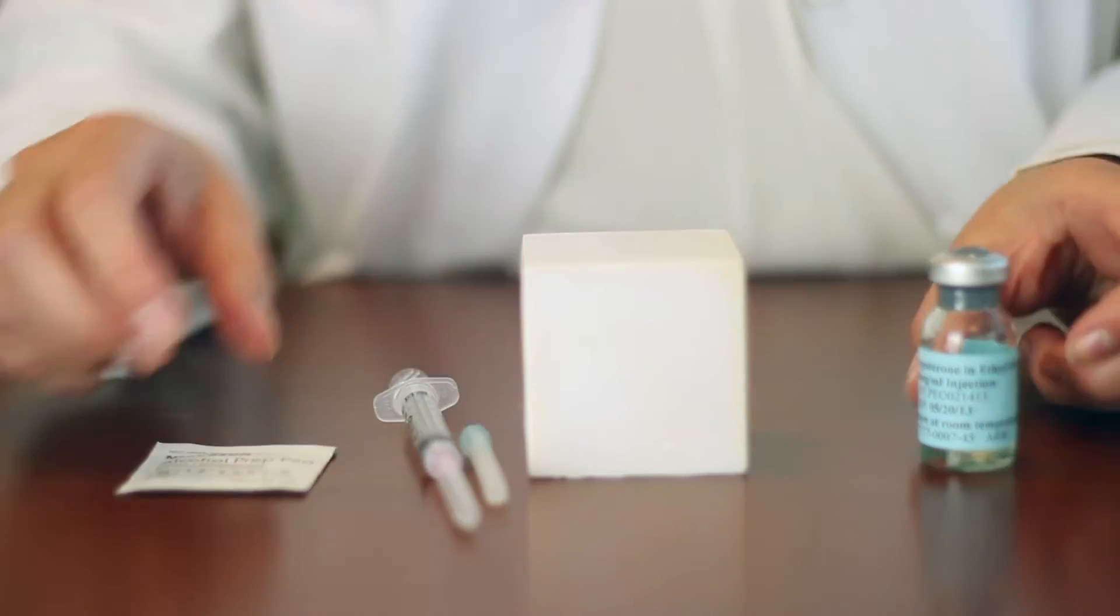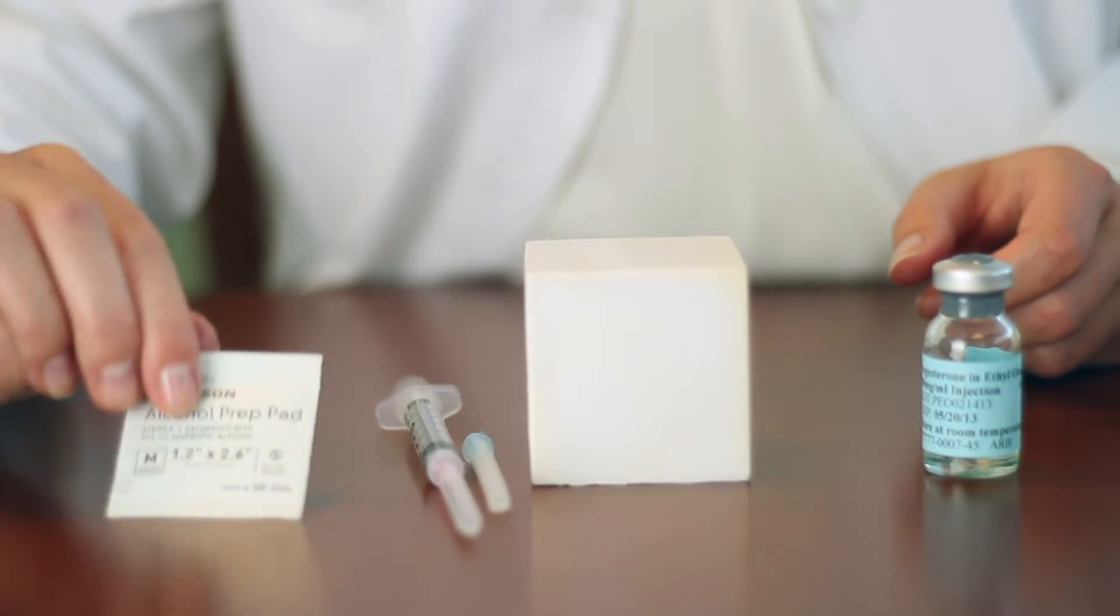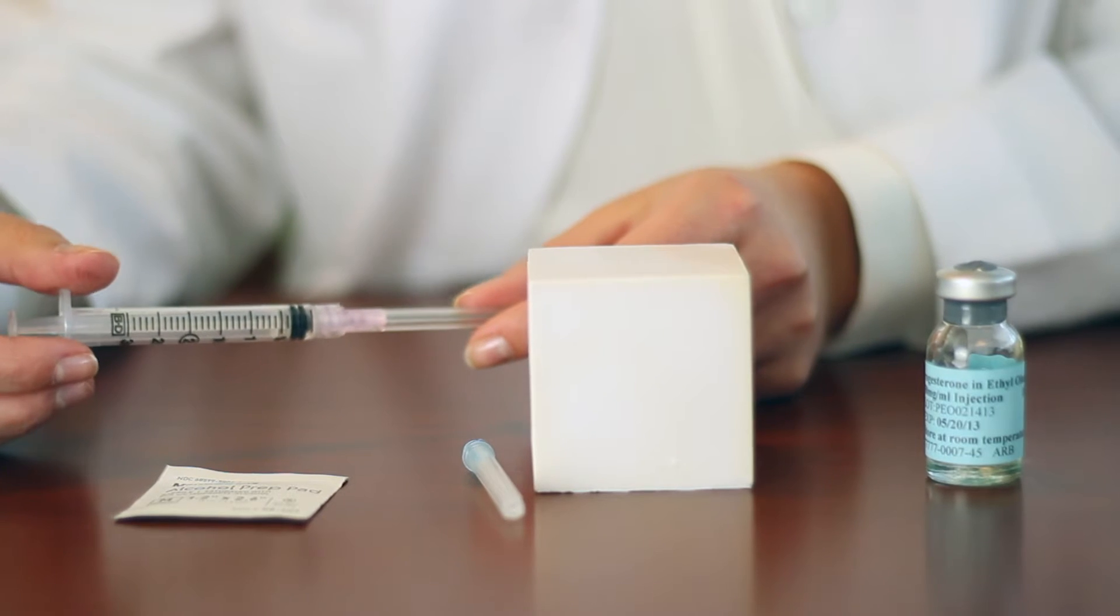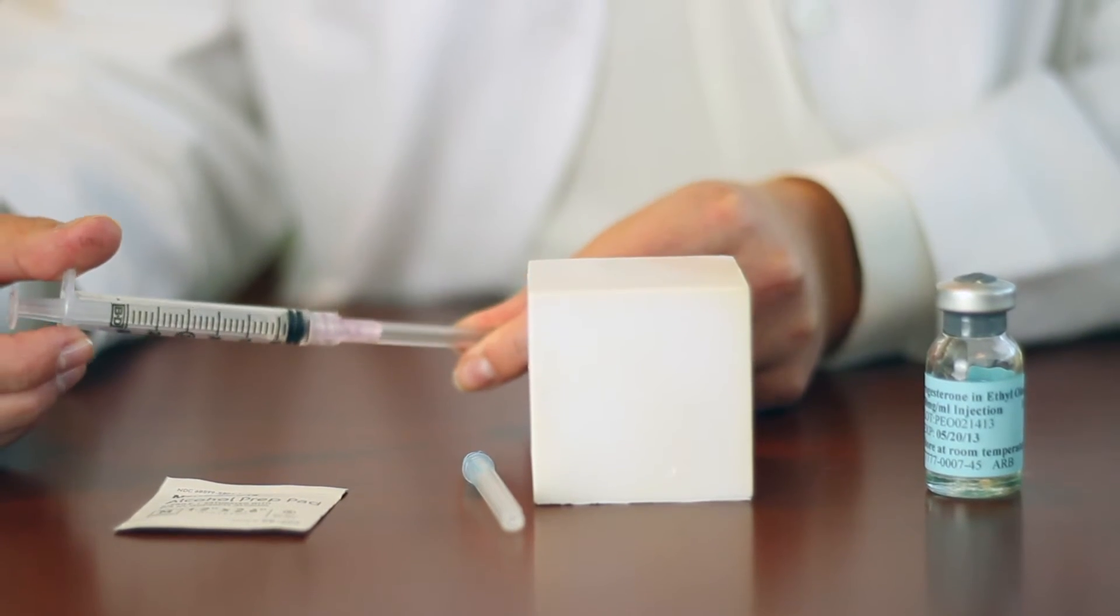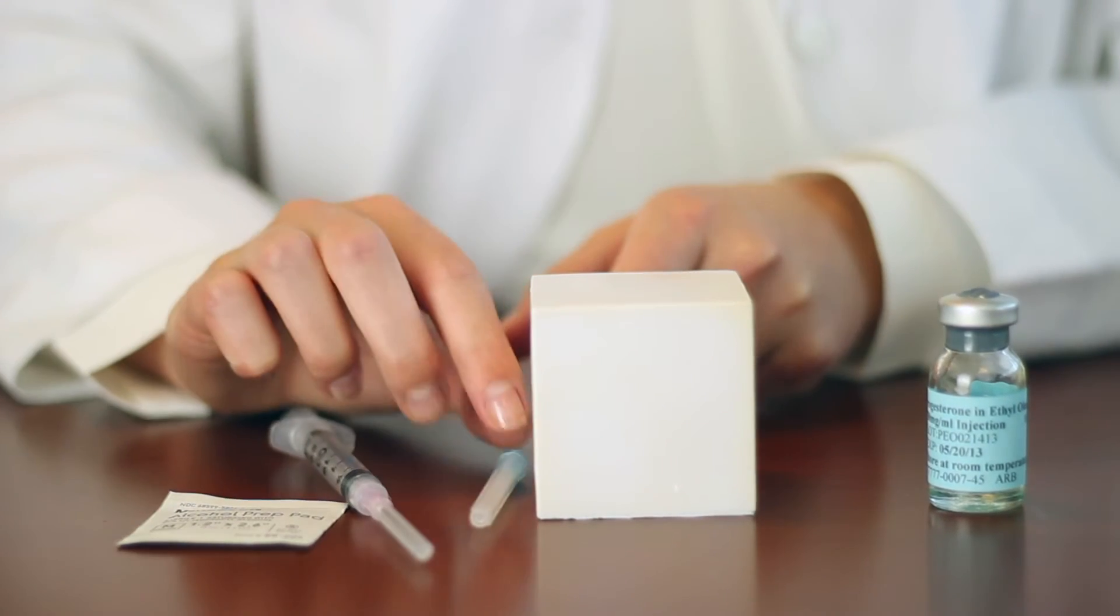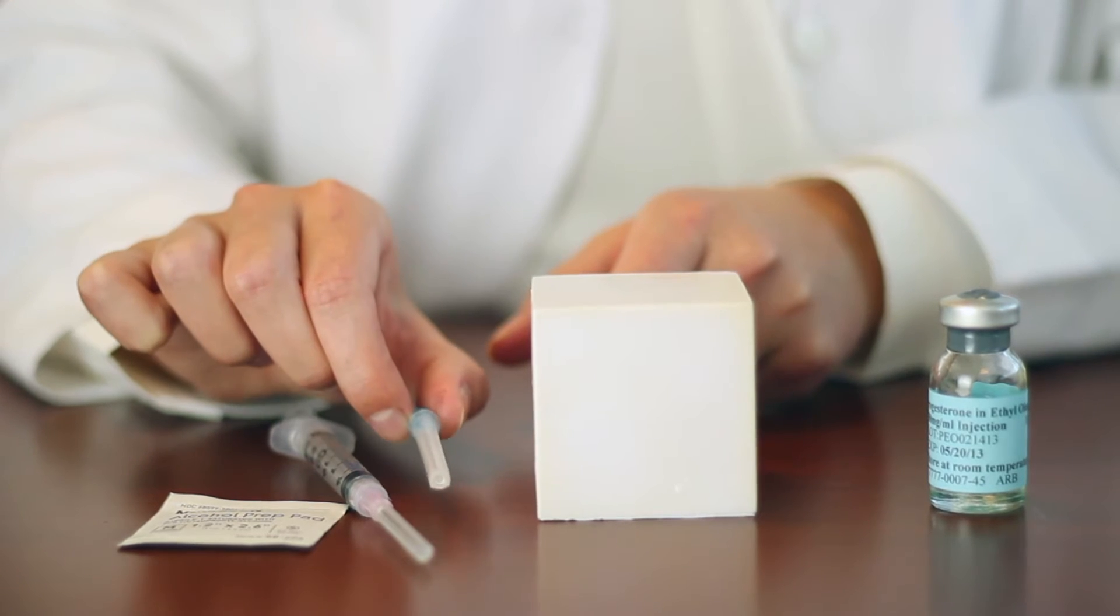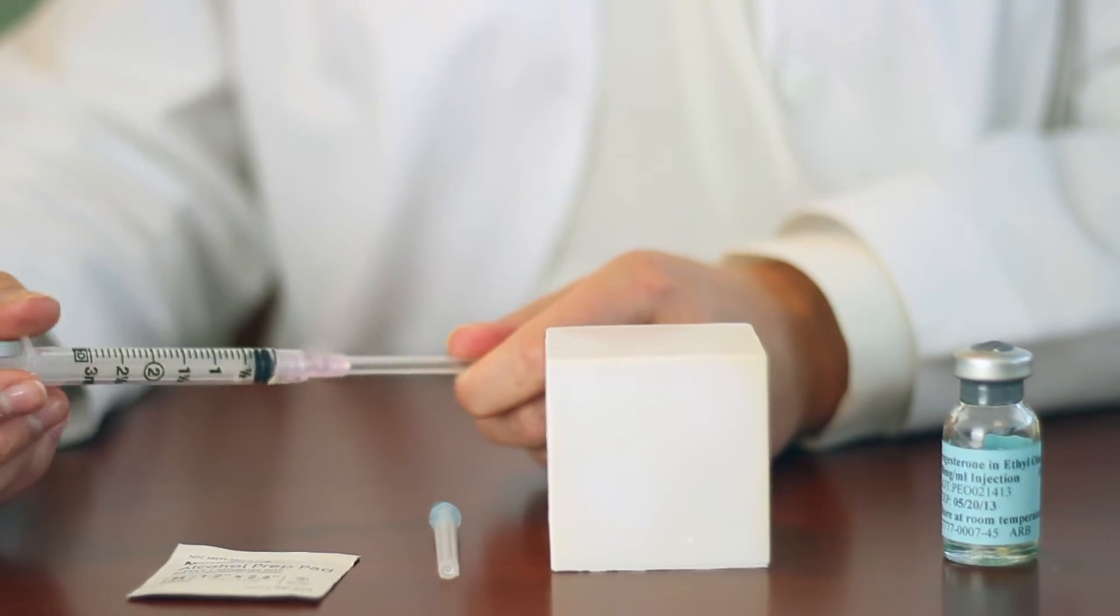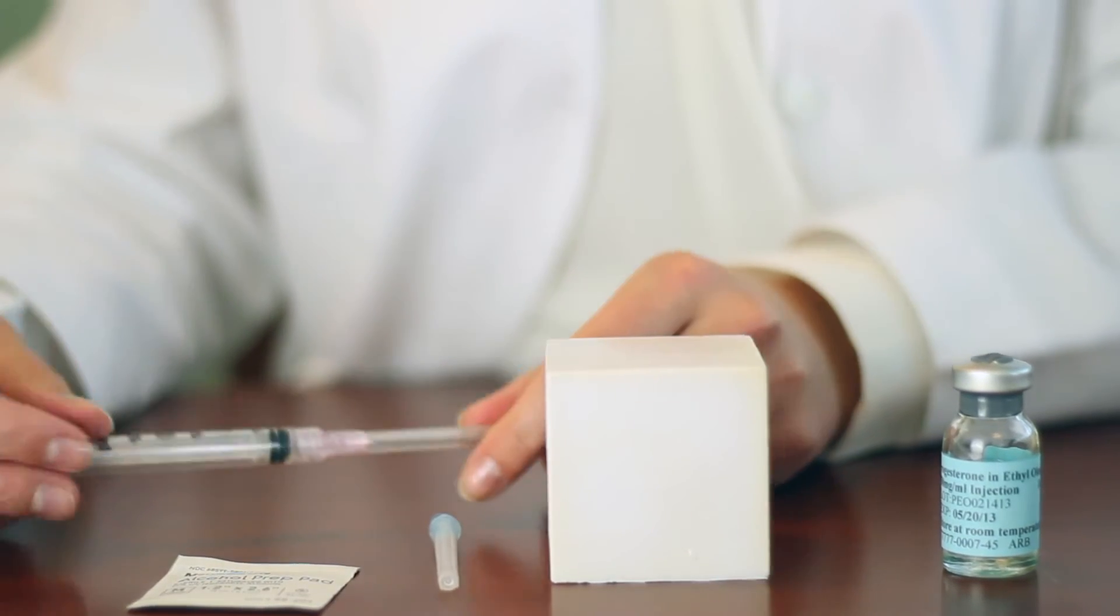You're going to want to have your vial, an alcohol swab, a 3 milliliter syringe with an 18 gauge needle, and your injecting needle, usually 22 or 25 gauge. You want to attach your 18 gauge needle to your 3 milliliter syringe.